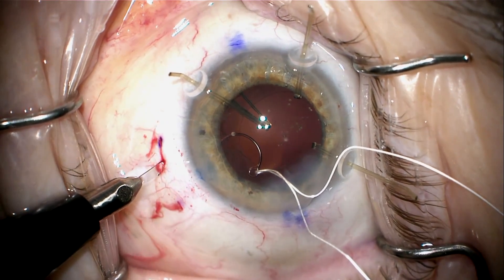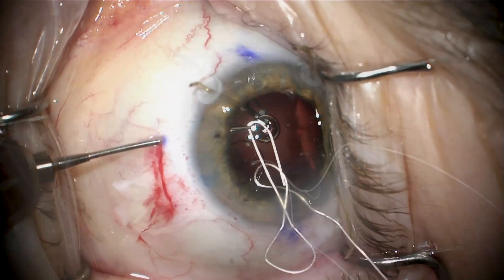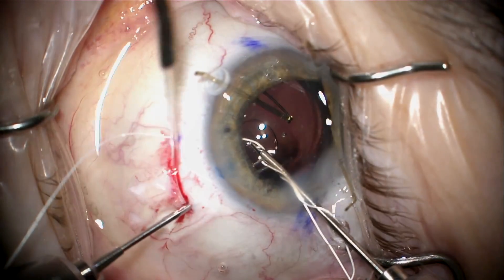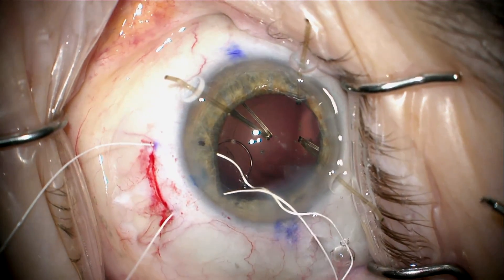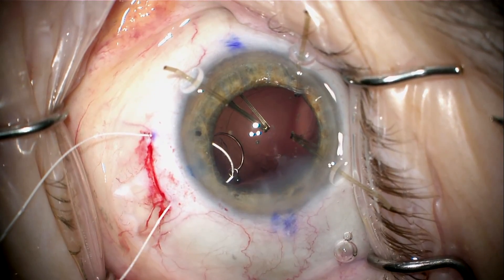I place two sclerotomies, two millimeters back from the limbus. I connect those with a scleral groove that's about half thickness. I'll now use a 25-gauge forceps to retrieve each end of the Gore-Tex suture, and we'll just leave that for later.